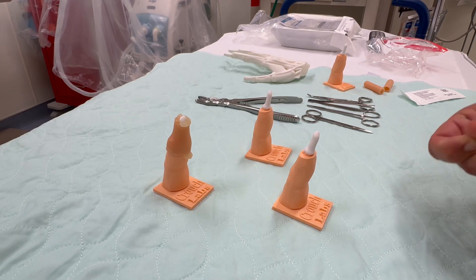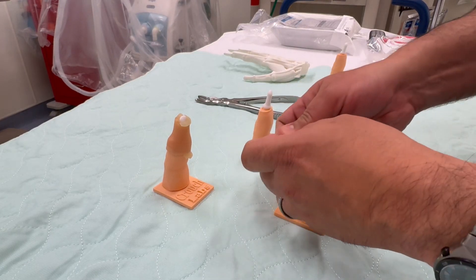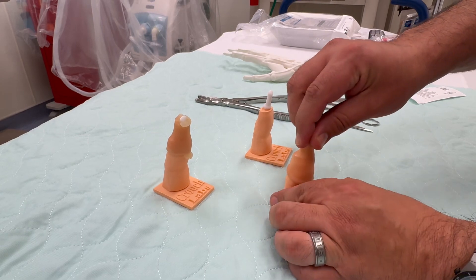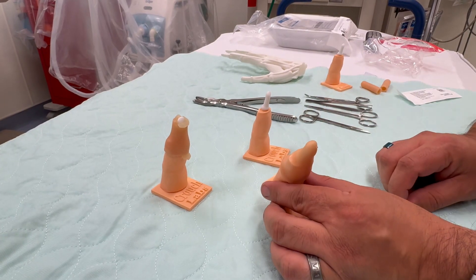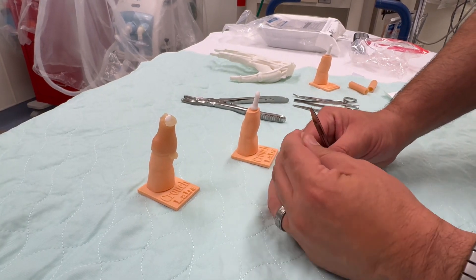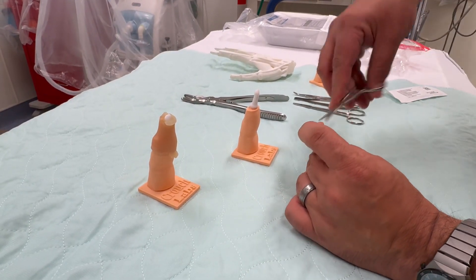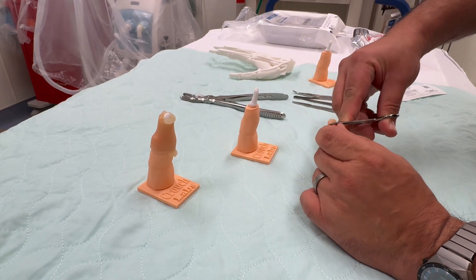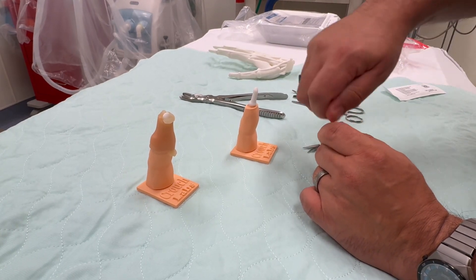For soft tissues we use a silicone sleeve that can be easily placed over the top and then cut. You can bolster this by adding gel of any kind underneath to give more soft tissue, and the silicone sleeve gives you a view of the overlying skin.